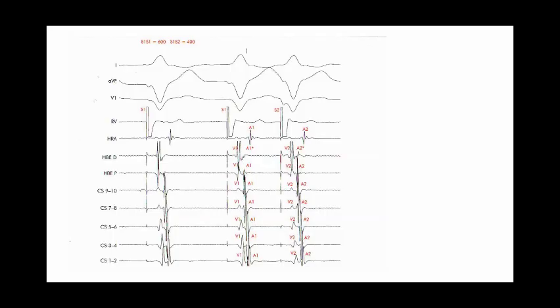What's meant by extra stimulus testing is that I have a train of usually 8 beats with a fixed distance, like here it's 600 milliseconds between S1 and S1. And at the end of the train, the ninth stimulus comes at a shorter interval. Here it's 400. I call this S2. And I'm repeating it. The next train is 600, 390, 600, 380, and it goes like this.